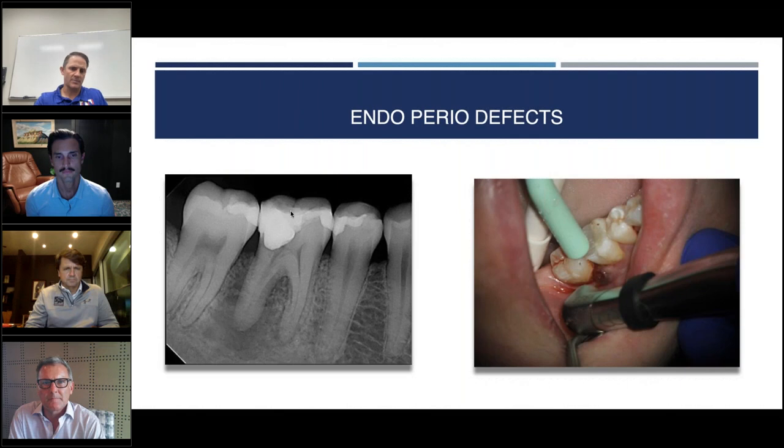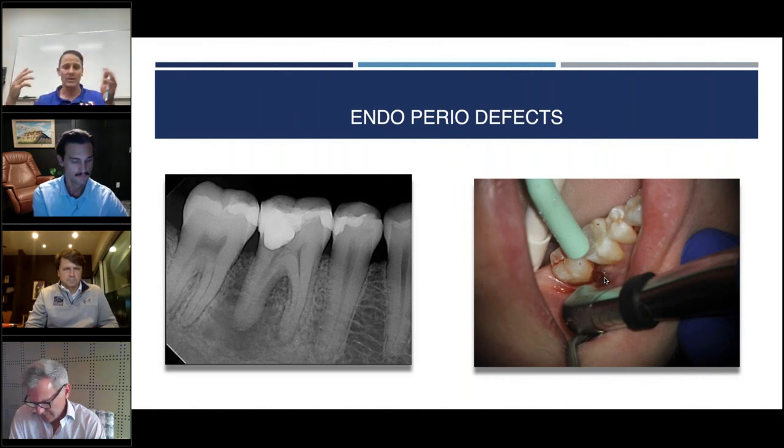So get this off my screen here. Sinus tract, patient presented with a sinus tract. You're going to use the number 3 tip, 1.5 watts, 30 hertz, about 50% water, 20% air. You insert the tip into the sinus tract or into the endoperio pocket, and activate just like you would in endo on the way out. Do that 3, 4, 5 times. Then I like to paint over the gingiva, putting a kind of bandage over that.